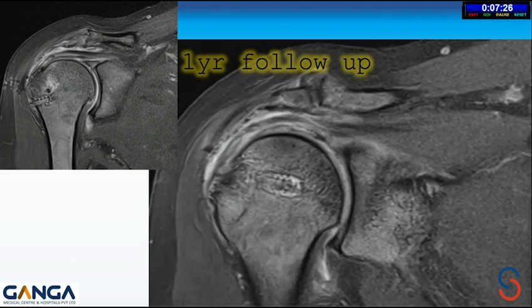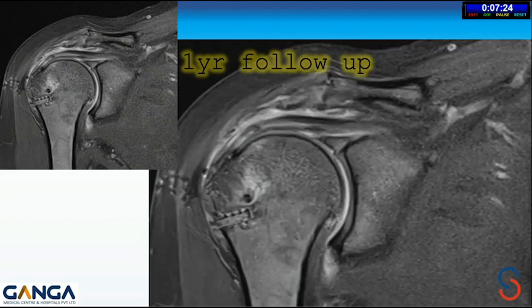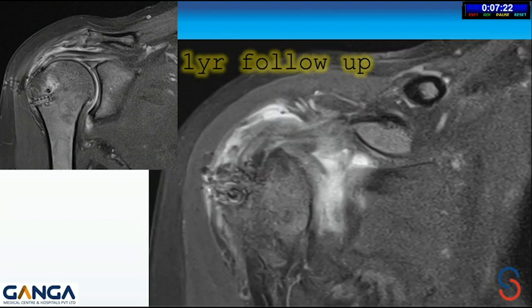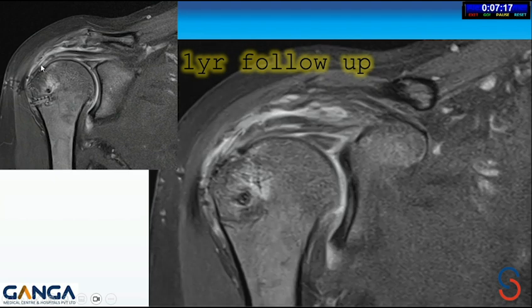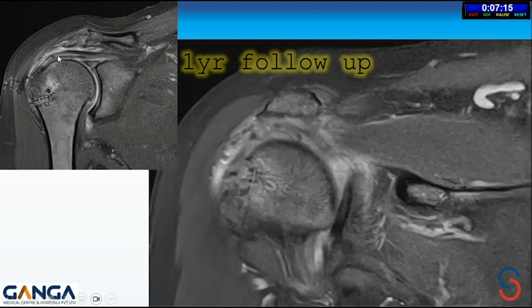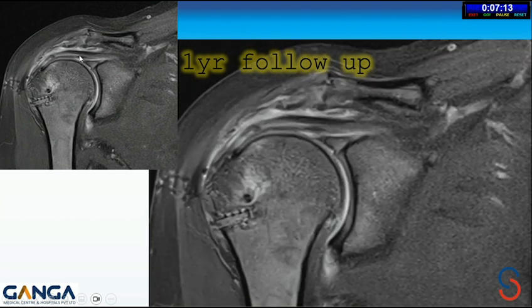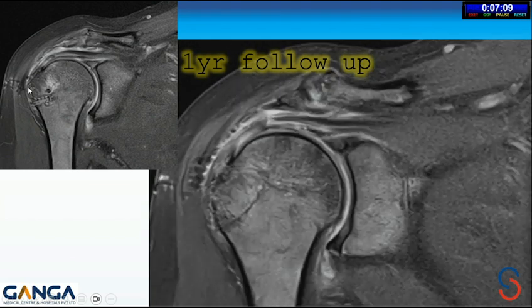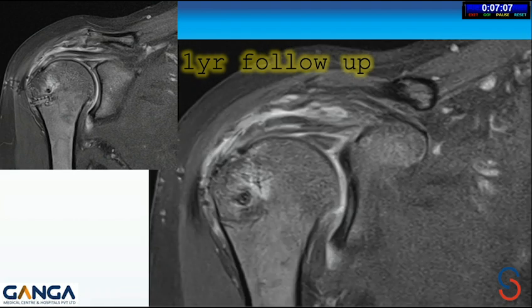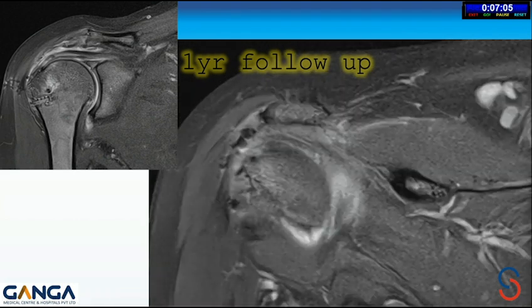We did a 1 year follow-up MRI. Here we can see that the distal stump has healed very well, but there is a small layer of signal which is seen there, but it has definitely healed well. This 1 year follow-up MRI shows the patient has a good result as well.